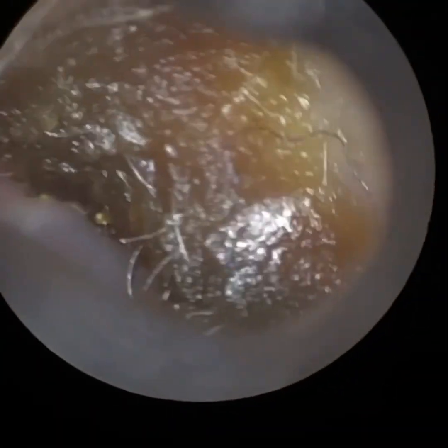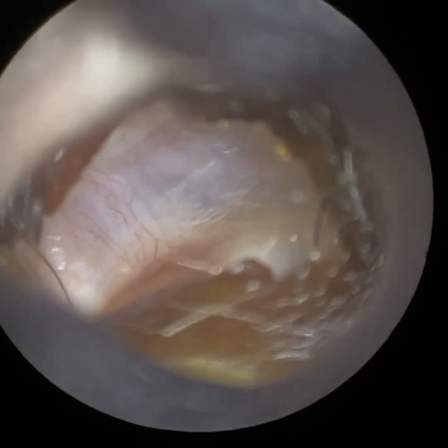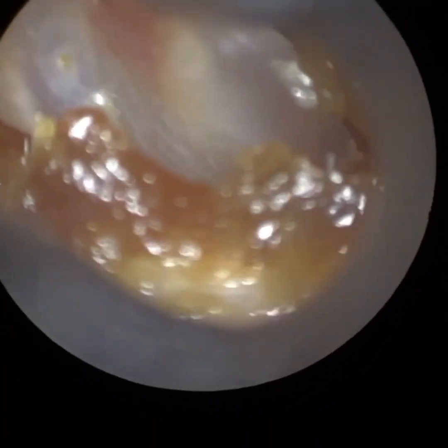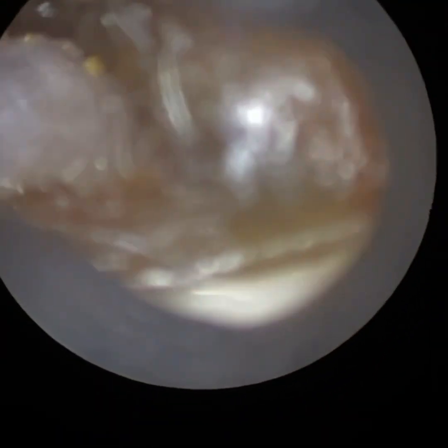Hi everyone, this is Mr. Neil Reiteter, Director of ClearWax and Consultant Audiologist. Thank you for joining me in another demonstration video of our newly developed Waxscope, which is due to be launched in early autumn 2022. So if you are interested, please do register your interest by emailing info at clearwax.co.uk.